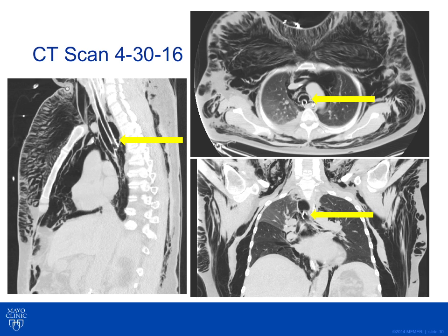The tip of the endotracheal tube, seen in the top right, is located between the trachea and the esophagus. The esophagus appears to have some contrast within it — an indwelling nasogastric tube with fluid around it — but no clear extravasation. The aorta is seen just to the patient's left side of the trachea. The endotracheal tube is not seen to be penetrating any other adjacent structures, though there is clearly air around the trachea where it should not be present.